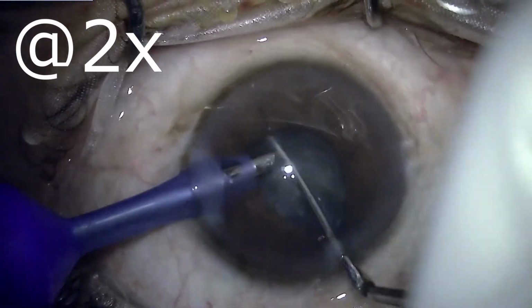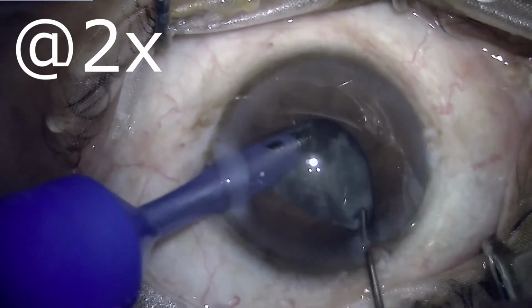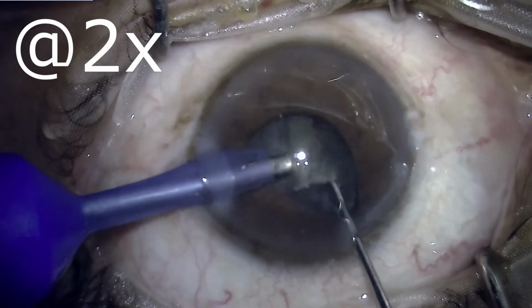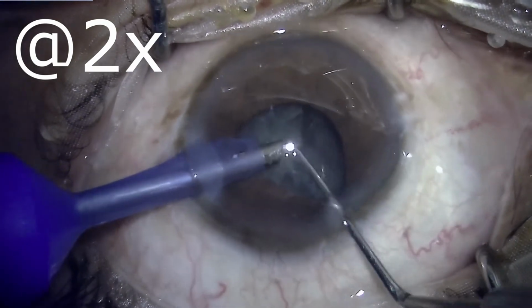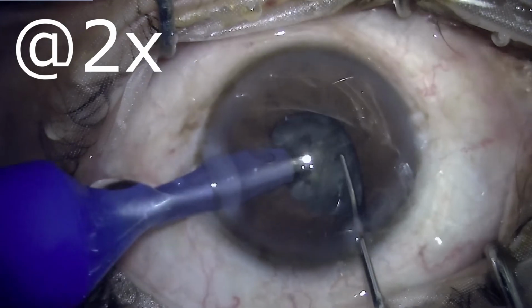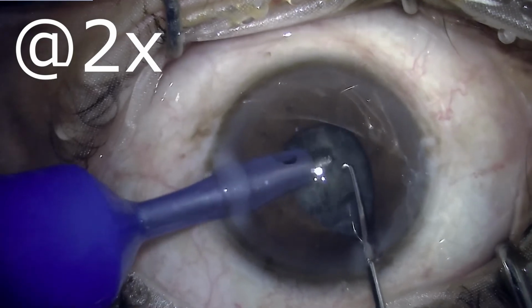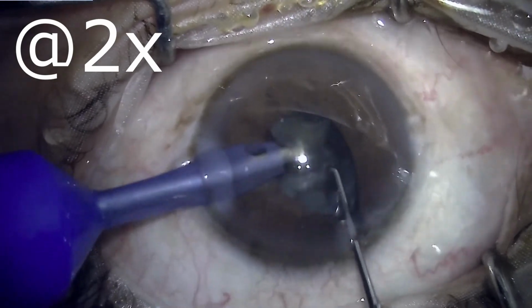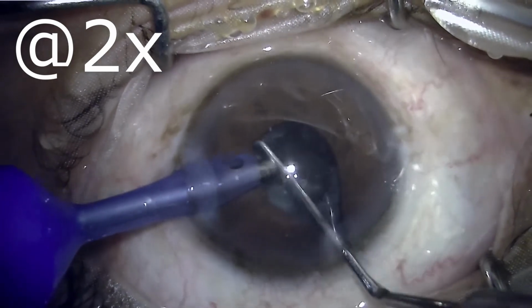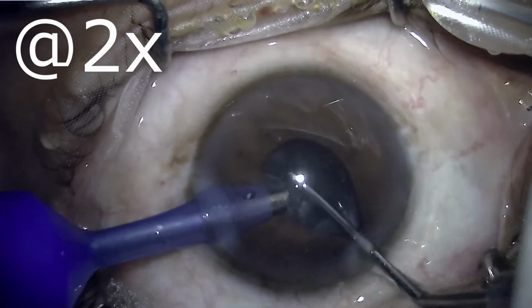We had seen that recently there was one more instance of catching the iris with a phaco tip. Now doing this cataract surgery in such a small pupil is a challenge, but with patience and some dexterity and good foot switch control it can be accomplished. One has to be very careful not to disturb the iris tissue as far as possible. The flow, the vacuum, each thing has to be very much controlled so that only a desired amount of tissue is caught hold of, and there is minimal surge so that the rest of the tissue which is not supposed to be coming towards the tip is kept away.